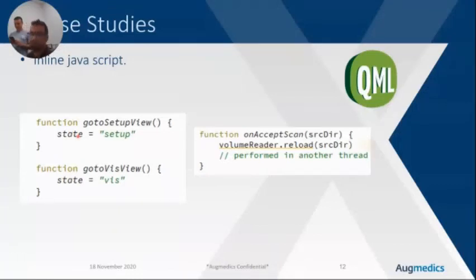But we can also use it for triggering some CPU- and time-consuming tasks, like you see over here, where we can reload some volume. Natively, those tasks will be executed on different processes and threads than the main GUI thread. We do it to keep the GUI responsive and free to process other events in the meanwhile.